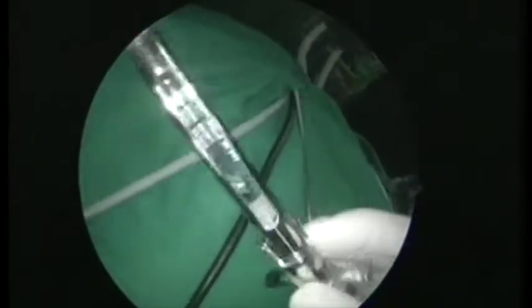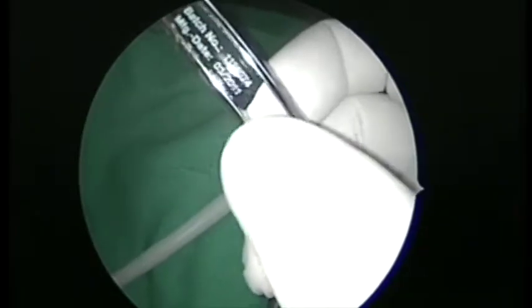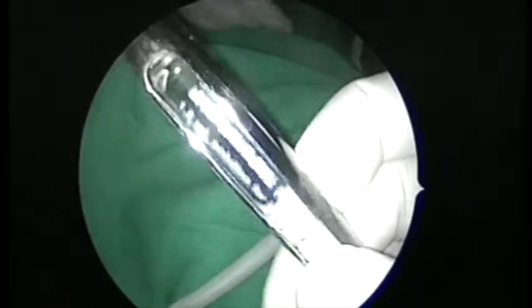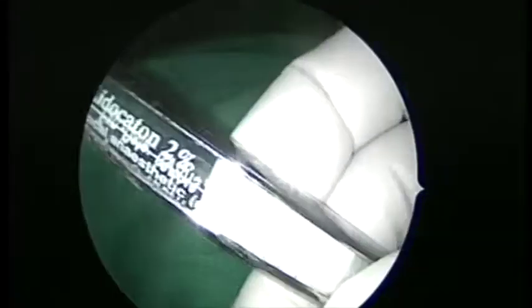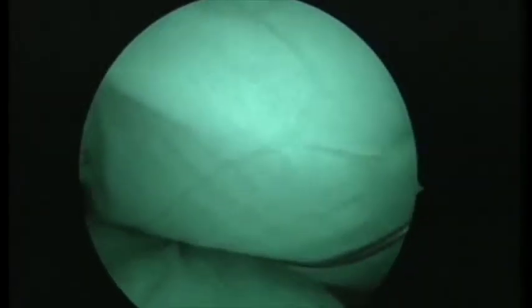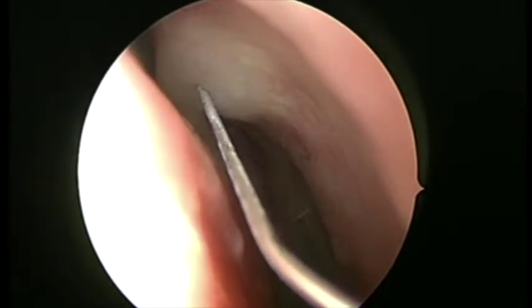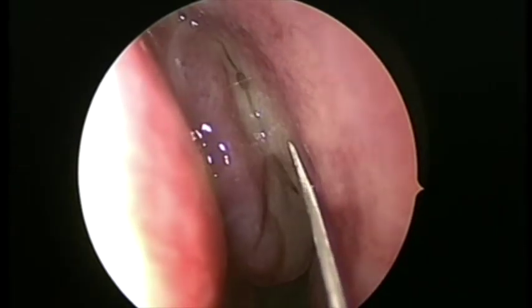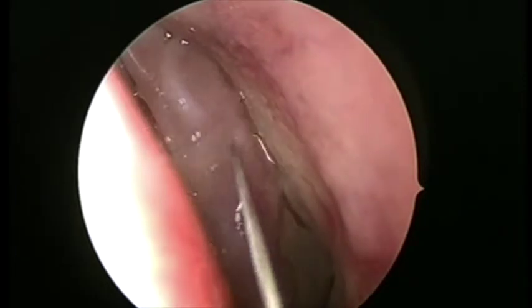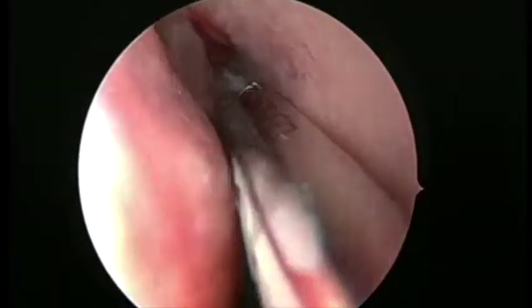I use this dental syringe with pre-prepared Astra cartridges. This is one-in-80,000 epinephrine - 1.8 mL solution containing lignocaine 2% and one-in-80,000 epinephrine. These are pre-prepared and come with a very fine needle, so we don't do the preparation ourselves. I am going to infiltrate the nasal cavity anteriorly - a little bit over the agger nasi, over the uncinate process, enough to get blanching. Sometimes injecting inside the polyp also helps. And that should be enough - so I am going to start with the surgery.